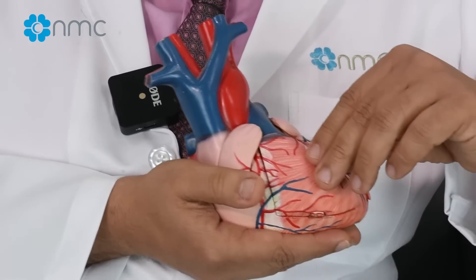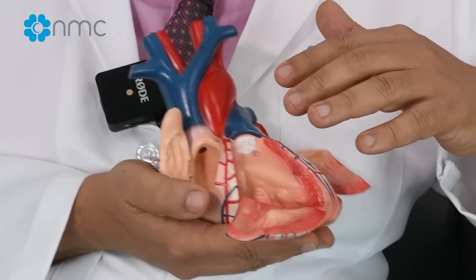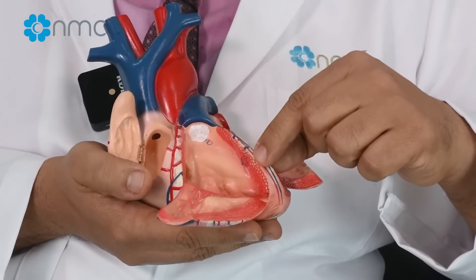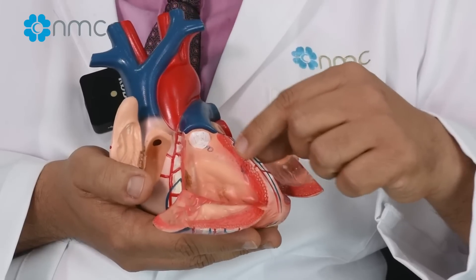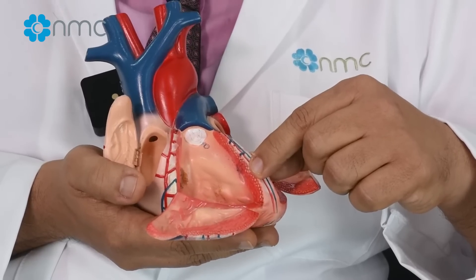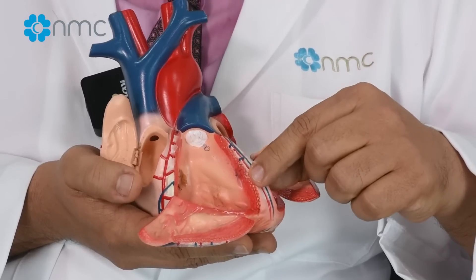When we see — we open the heart like that — the echo-Doppler shows what is inside our heart. Here is the most important part: it is called left ventricular hypertrophy. This part becomes more of a concern for patients who have hypertension or uncontrolled hypertension. This can only be evaluated by the echo-Doppler.